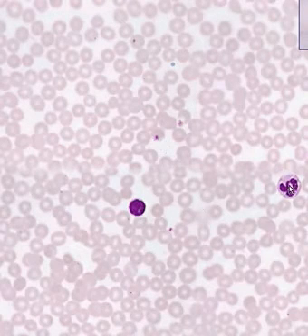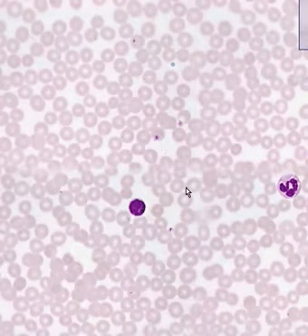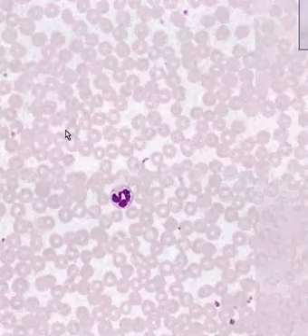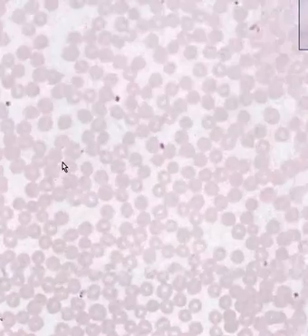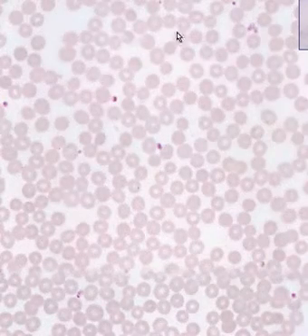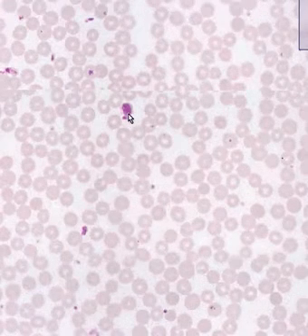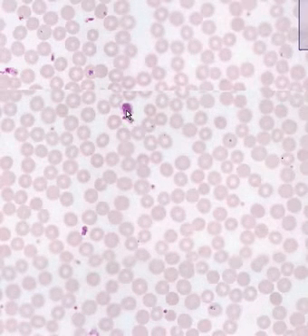You could see here's another neutrophil. Here's another neutrophil. Here's another lymphocyte. All the rest of these are red cells. All these little pink dots are platelets. And let's keep cruising around. Here's a platelet. Here's a platelet. The rest of these are strictly red cells in this area. Here is perhaps a large platelet or a fragment of a cell.